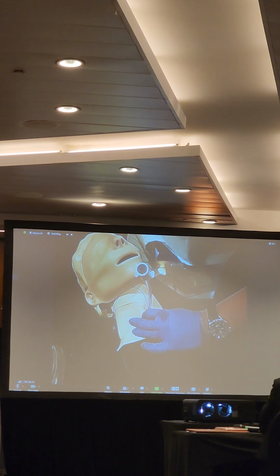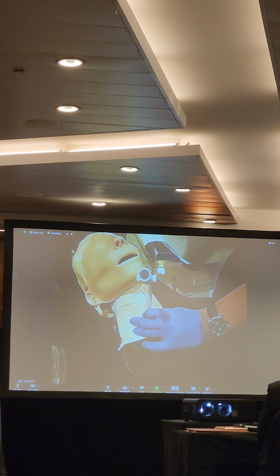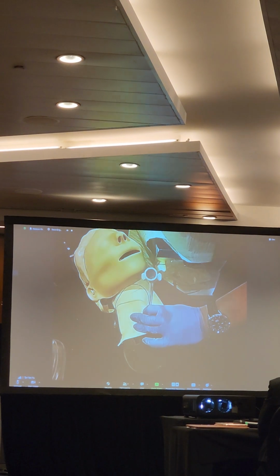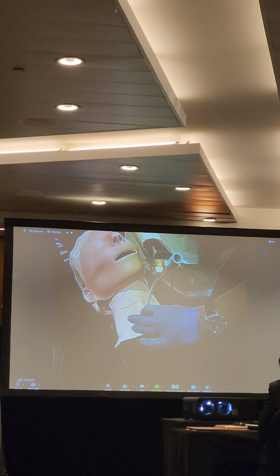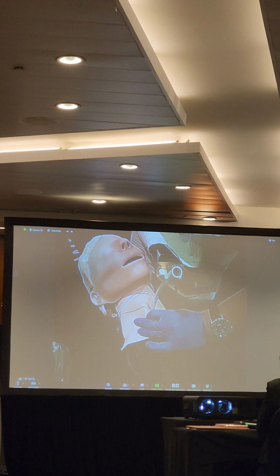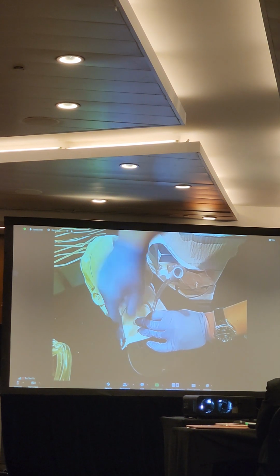I think Alex and I had a recent experience with a surgical cricothyroidotomy patient. After the insertion of the ETT, there was capnography, but the patient persisted in desaturation. In this case, which is very important, there was a bit of endobronchial intubation. It's actually quite common as a mistake in the heat of the moment when you insert the ETT. So it's very good to check the positioning and to withdraw the ETT as appropriate. Don't put it too deep or too enthusiastically inside, so that you avoid any endobronchial intubation.